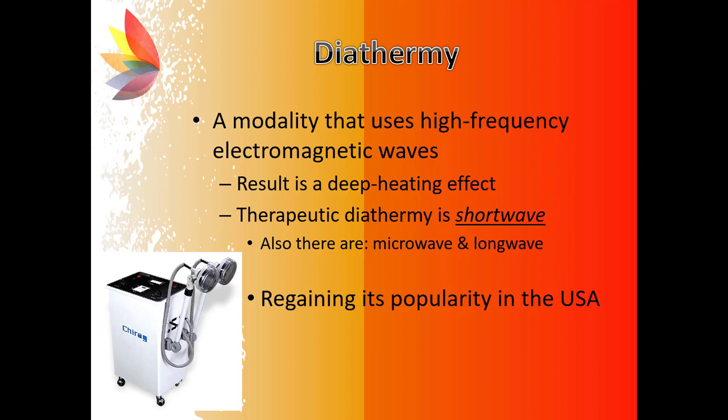Diathermy treatments are commonly used in other countries, such as the United Kingdom. Diathermy is used infrequently in the United States for several reasons. Diathermy units are very expensive. Diathermy usage has been plagued with infamous folklore and misinformation about treatments, which is mostly due to outdated research. However, diathermy has recently started to gain some popularity within the United States as a therapeutic treatment device.